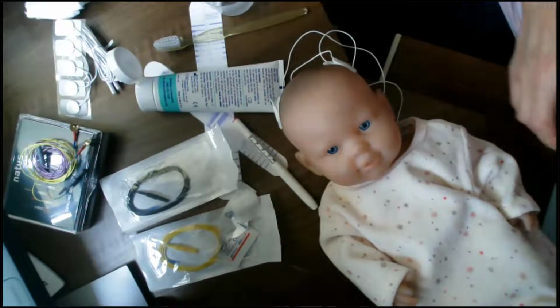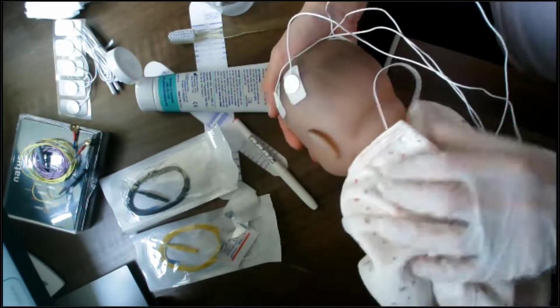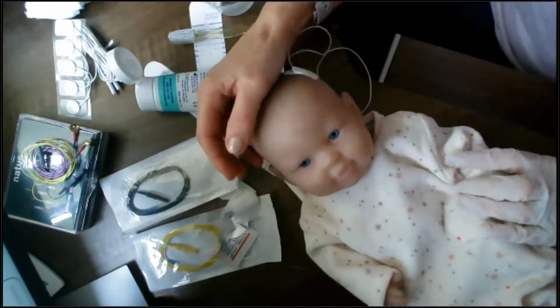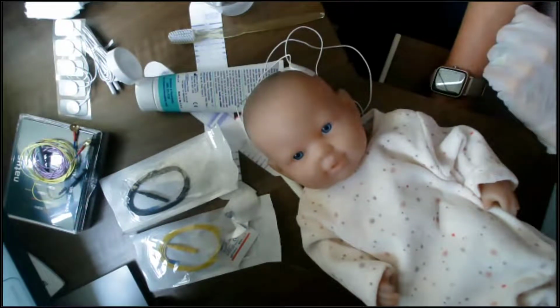And then once I've done that, I'll do the same thing with my ground or reference electrode and make sure that I've got that placed directly on there. But again, I'm going to show you actually very shortly a video of actually doing this on a real baby so that you can see exactly what this looks like. So let's go back and talk about the cup electrodes.